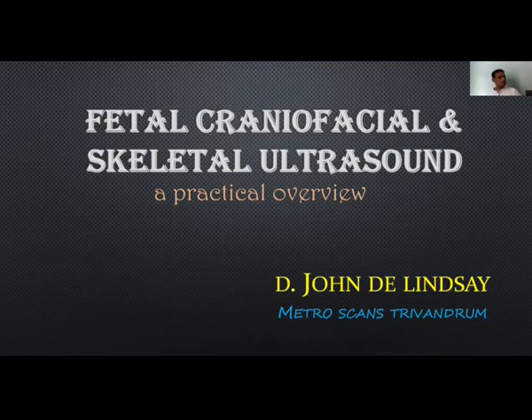First of all, why? What is the link between craniofacial and skeletal ultrasound? I picked up two areas which are external birth defects. The aesthetic impact it has on the fetus and its life, family, and also even the radiologist, in terms of a medico-legal perspective, is important in these areas. So it's absolutely mandatory that we go through a structured ultrasound and seek fine aspects in evaluating these areas.